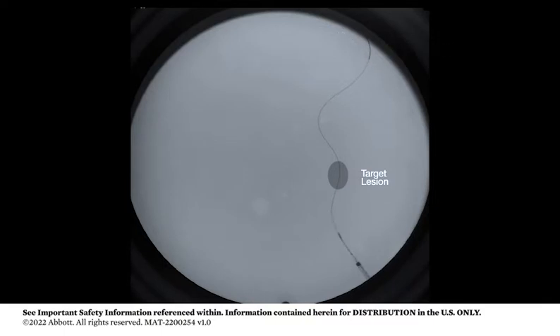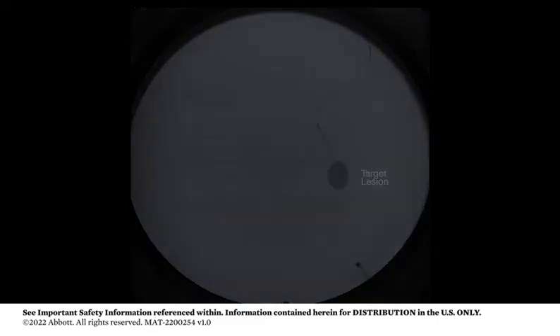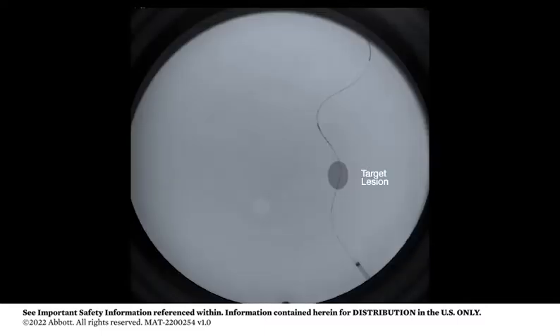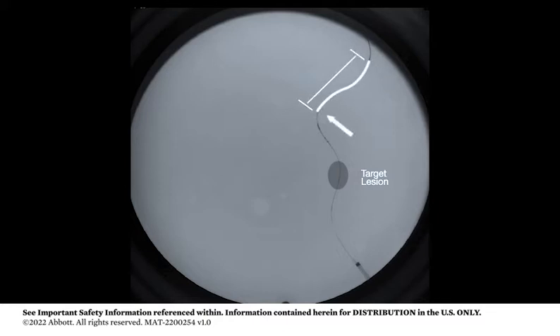Carefully advance the delivery catheter over the bare wire to the intended filtration element deployment site. Do not torque or pull back on the delivery catheter during advancement. Torquing the bare wire against resistance may cause wire damage and/or tip separation. Before filtration element deployment, ensure there is adequate distance between the 0.019 inch step on the bare wire and the distal tip of the filtration element to avoid unnecessary contact during the procedure.